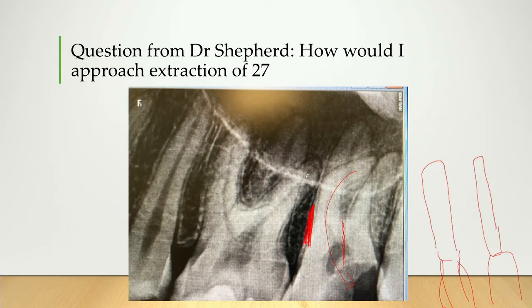So an uncontrolled use of a luxator is definitely potentially dangerous. However, I don't use elevators at all. I only use luxators. So I think elevators are actually quite useless in terms of extraction technique. So in answer to your question, possibly luxators can be dangerous if you don't know how to use them, but luxators are just so useful in these situations. I don't see how you could even get an elevator into this kind of area, into this space, small enough to then rotate these roots out.